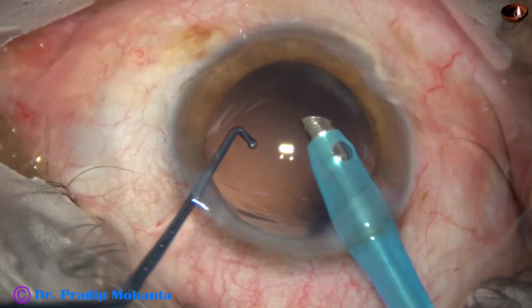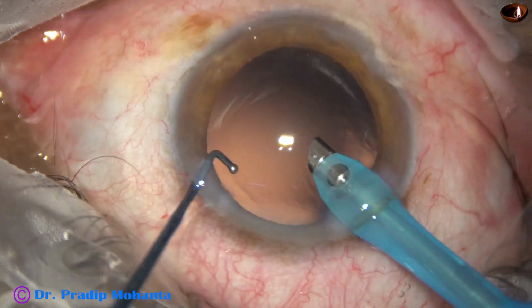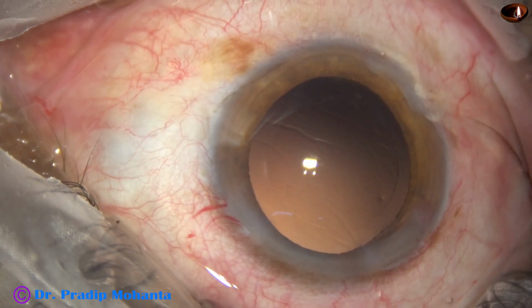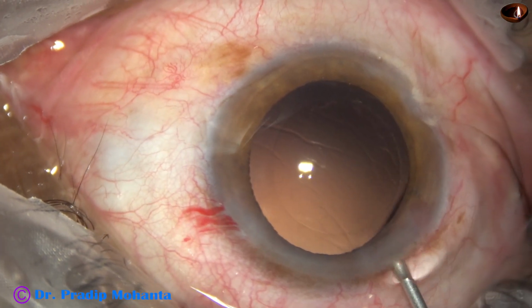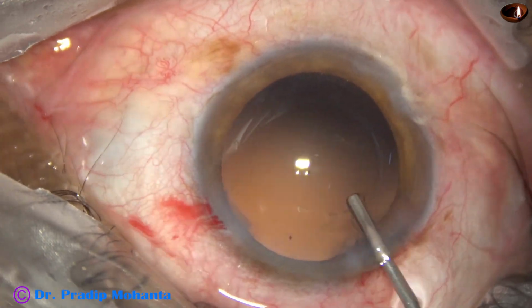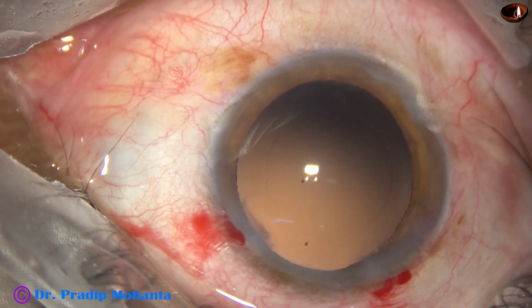I am not encouraging the beginners to do this. This may look dangerous, but see, all the cortex, including a cell that was sticking to the posterior capsule, has been removed. And now I fill up the anterior chamber with visco. Capsular bag as well as the anterior chamber is filled up with visco.